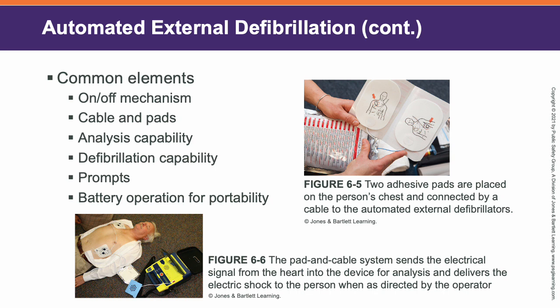Defibrillation, it has the ability to shock the heart to get it beating normally. It will also prompt you, so it talks to you. Think of it like Alexa or Siri, right? Telling you what to do, telling you when to stop doing CPR, or when to continue doing CPR. They're very smart. They're made very well to make it very easy for you. And they do have batteries inside them. They're not wall plugged in, which means you can use them anywhere. That makes them very convenient and easy to use.